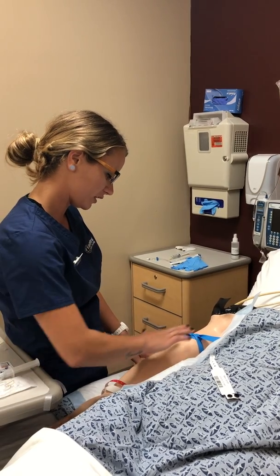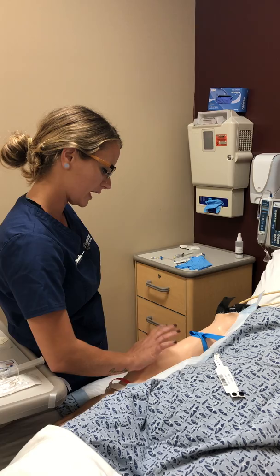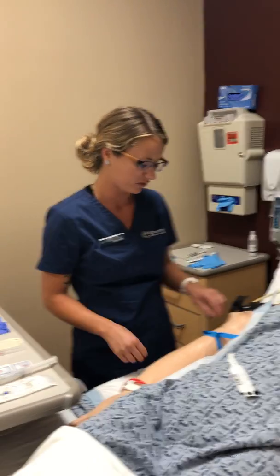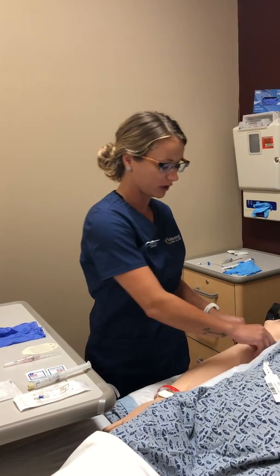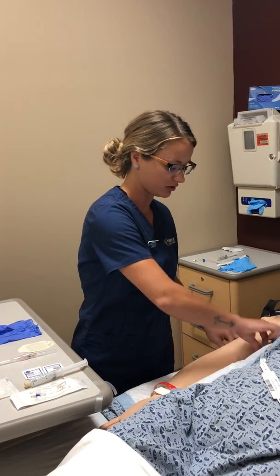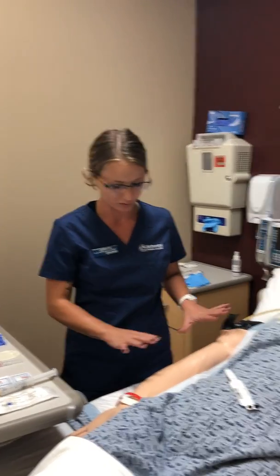I see I have a nice straight protruding vein right here. Some ways to bring that out is to lightly tap it, which will bring it to the surface. Another way to check is to apply heat to the extremity before inserting an IV, so a warm blanket, wrap it for about 15 minutes. But this, I found a good vein. It's nice and straight, so I know which one I want to use. So I have all that ready.